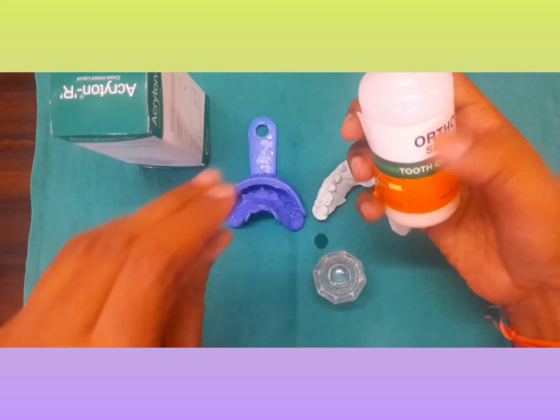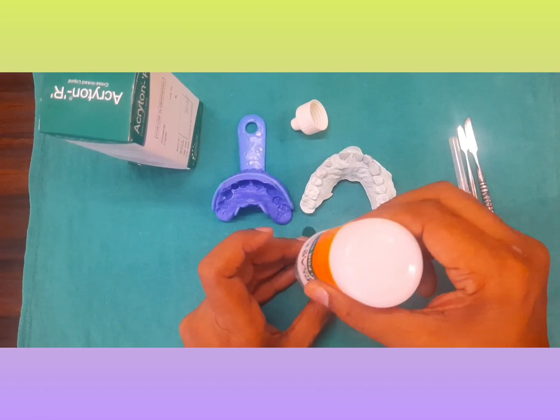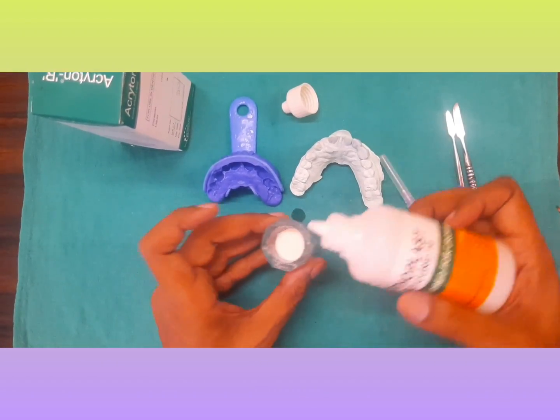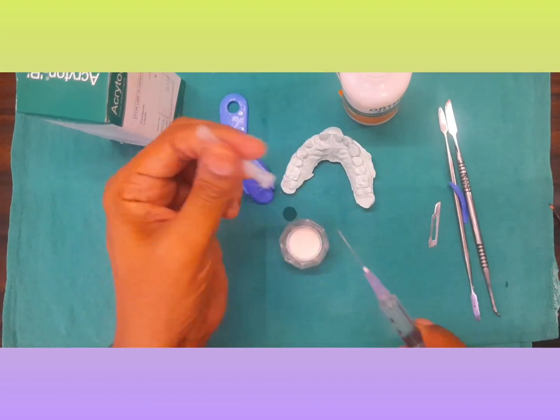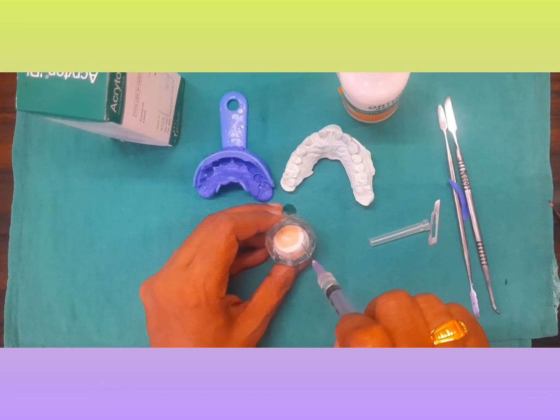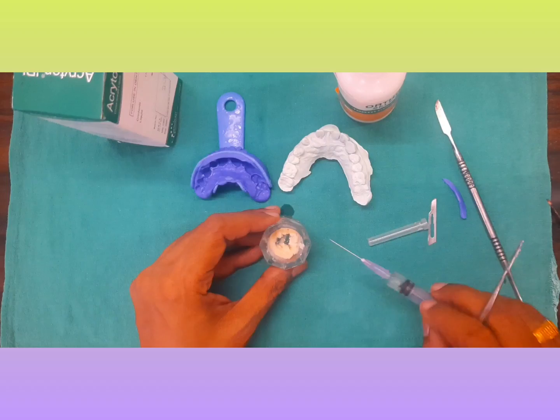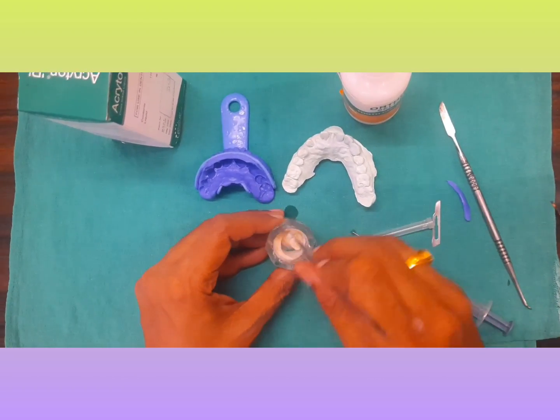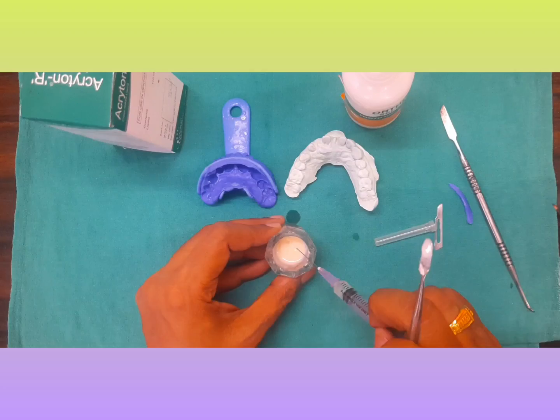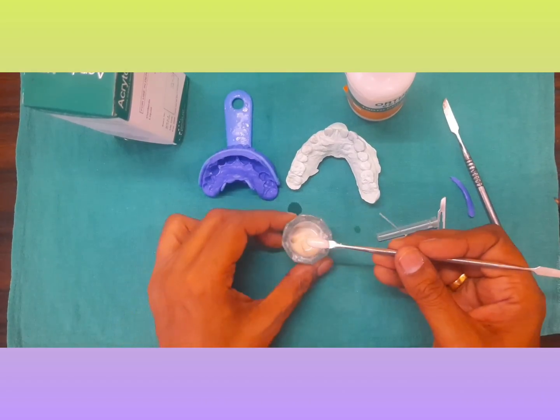Once you have done that, take your tooth-colored self-cure acrylic and take it in a dappin dish or a porcelain jar. Take an appropriate amount — take the powder like this and the liquid. Mix the liquid appropriately. You can take slightly more monomer. Once you have mixed it, you should be fast in loading this.